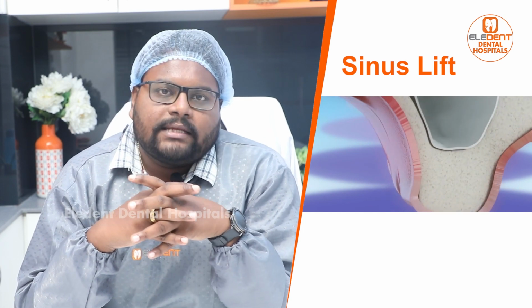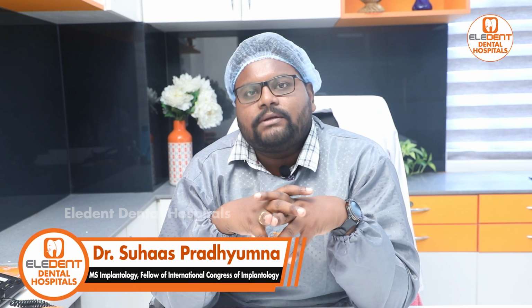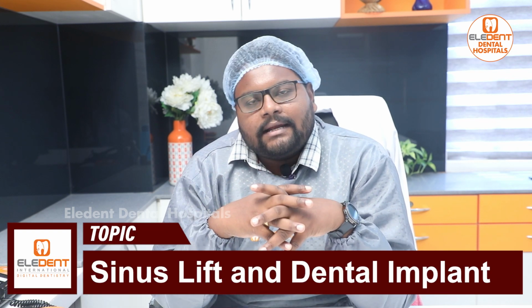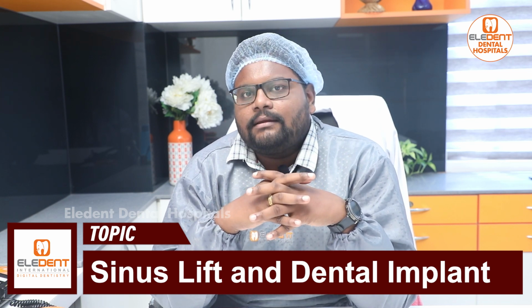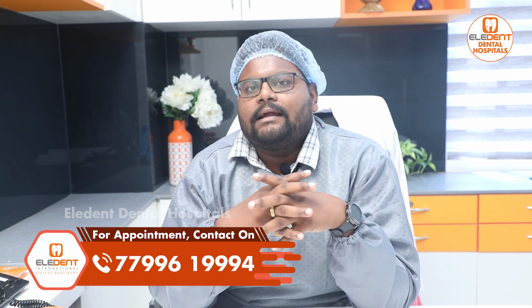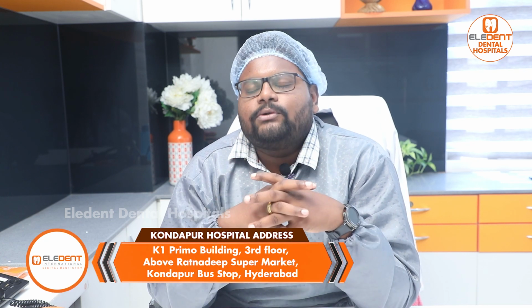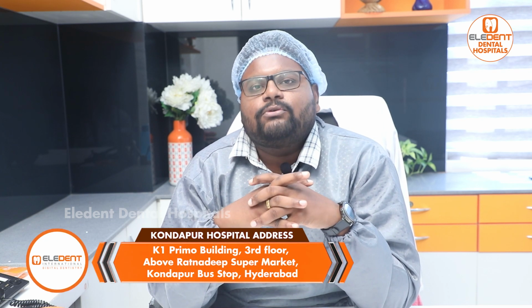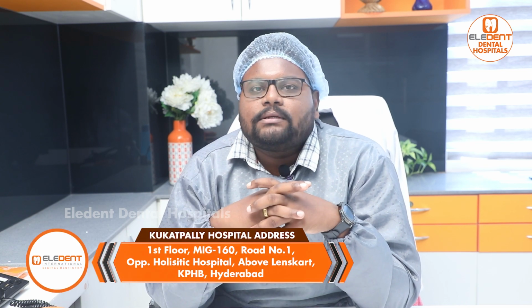There are again two scenarios in which we can place an implant along with a sinus lift. It is called either a simultaneous implant placement with lift or a delayed implant placement with lift. A simultaneous implant can be placed when we see that the available bone is sound enough to hold the implant and we get good primary stability. In that situation we do a simultaneous placement. But if you find the bone not good enough to hold the implant, then a delayed approach is advised. That is basically about sinus lifts.